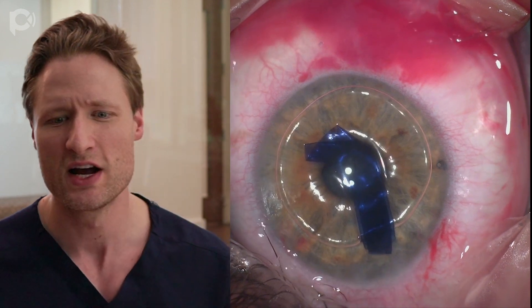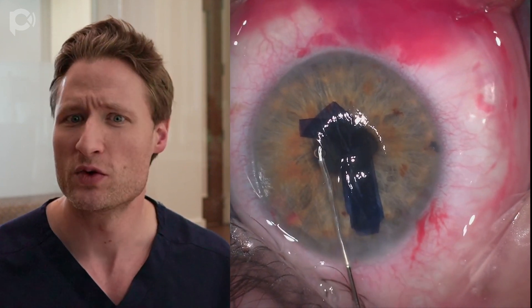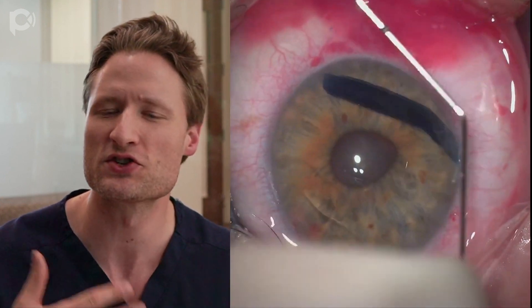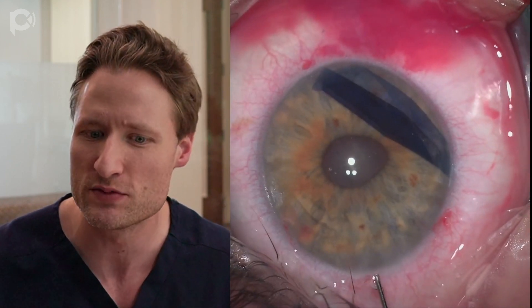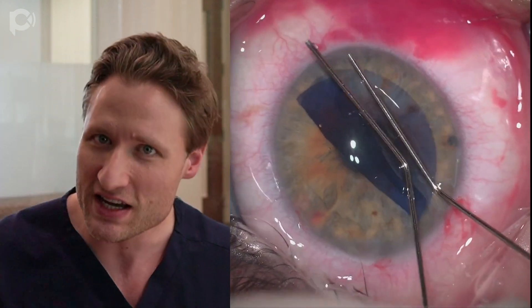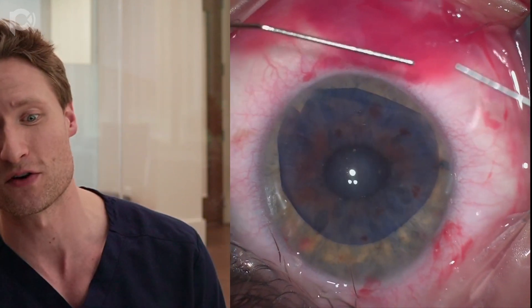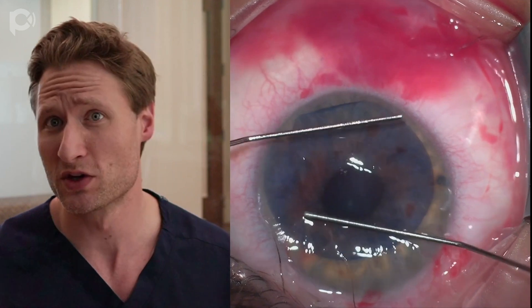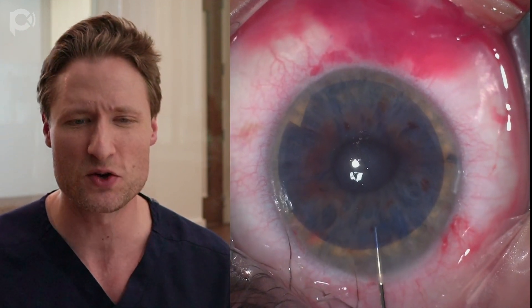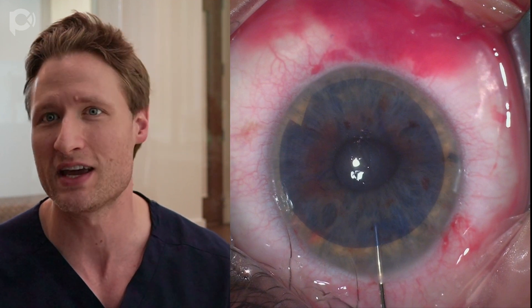We've injected the graft into the anterior chamber. I'm removing this bubble that came with the tissue, which will allow the tissue to start unfolding. When you use a DMEC graft in a phacic eye, you're going to have a shallow anterior chamber, so you want a graft that's a little bit smaller than you might otherwise use because there's less room to unfold. Unfolding is actually easier in phacic eyes because there's compression between the back surface of the cornea and the anterior surface of the iris — but that same compression makes it difficult to flip the graft if it's upside down, so using a smaller graft makes it easier to tumble it in the anterior chamber if needed.